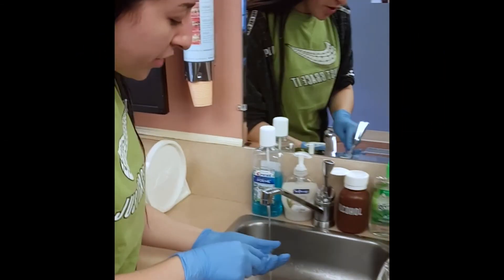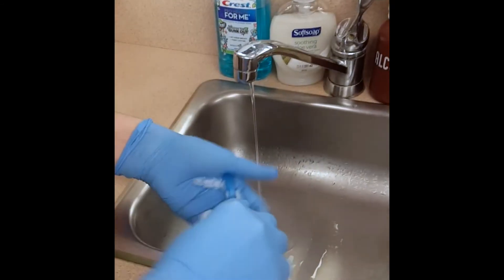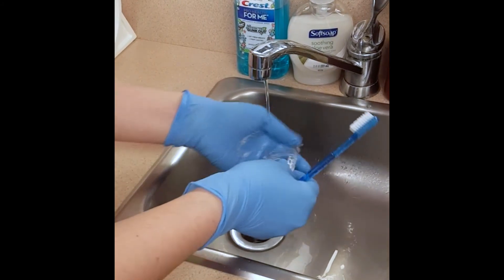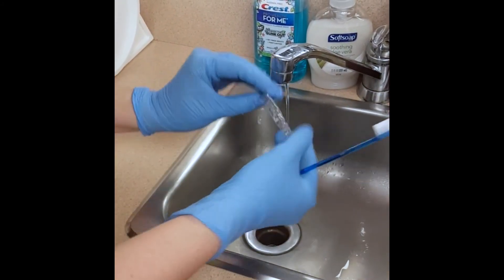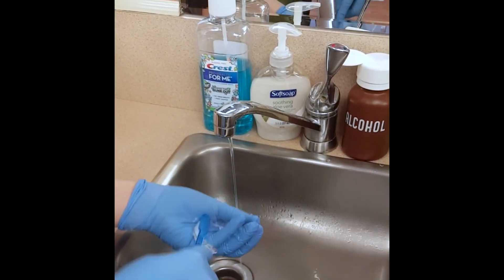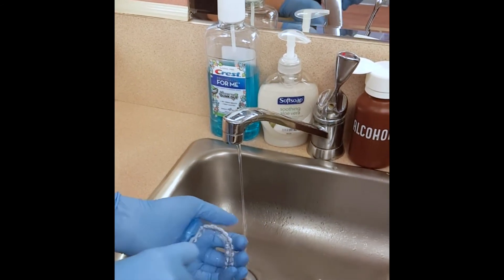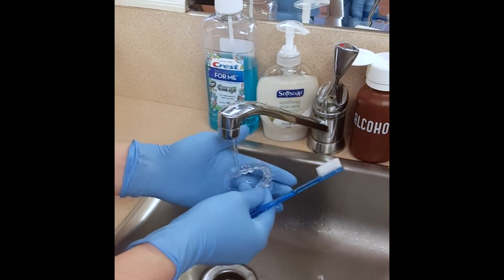When cleaning your retainers, it's very important to remember to use cold water only. The retainers are made of plastic and using hot water can potentially distort them. You can use whatever's left on your toothbrush after brushing your teeth to help clean them. Just hold it in the palm of your hand and gently scrub along the inside and the outside of the retainers to remove any excess food debris. It's important to keep up with cleaning your retainer because over time the food debris can harden, which is very difficult to clean off and can cause the retainers to no longer fit properly. Also, don't forget to rinse your retainers before you put them in your case to get rid of any excess saliva.